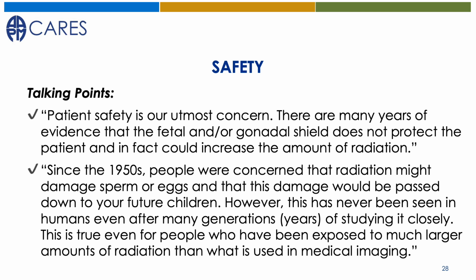For example, if a pregnant patient with suspected pulmonary embolism refuses to have imaging done without shielding, then the benefit of getting a timely diagnosis outweighs the risk posed by using shielding. Similarly, for the parent of a critically ill pediatric patient, the psychological benefit to anxious parents or caregivers may exceed the risk posed by shielding.